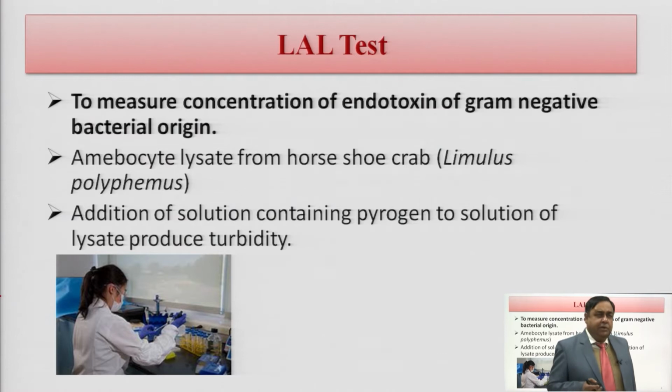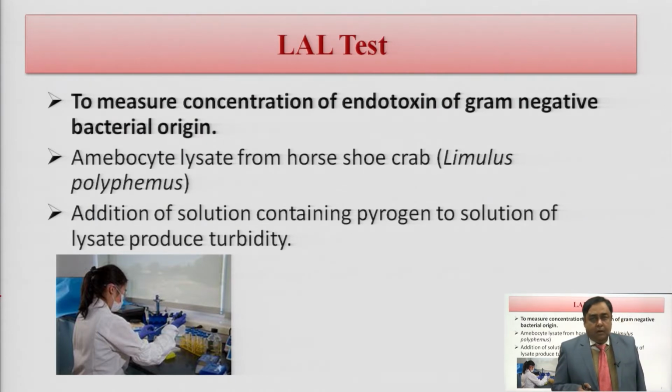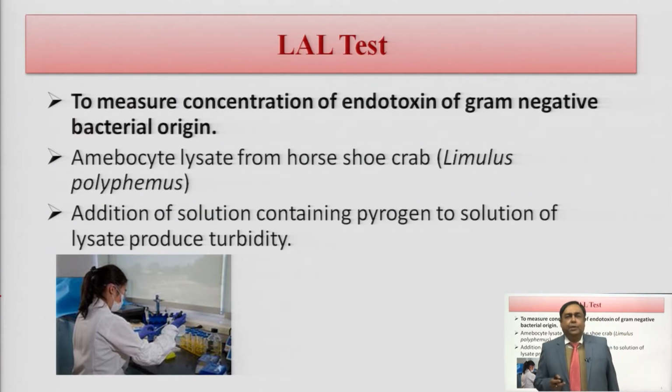The problem with pyrogen is, whenever we are taking a preparation which is containing pyrogen, a metabolite of the gram-negative microbes, this pyrogen is found to create a fever. And this was utilized to evaluate the pyrogens taking the help of the sham test and the main test using rabbits as an experimental animal.